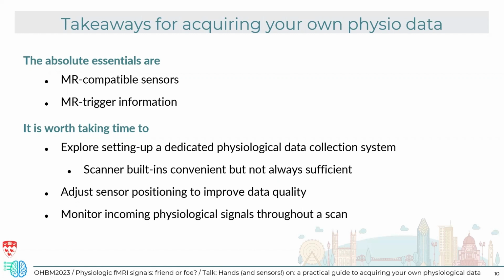And I really think it's worth taking time to explore this if you want to do any kind of sophisticated physiological data analysis. As well, really pay close attention to your sensor positioning, both at the start of the scan and throughout the scan. Monitor what's happening so that you can make adjustments to make sure that you're sensitive to the signal features you want to be sensitive to.